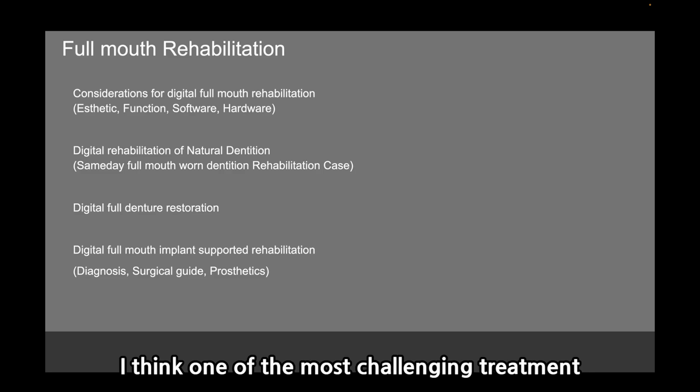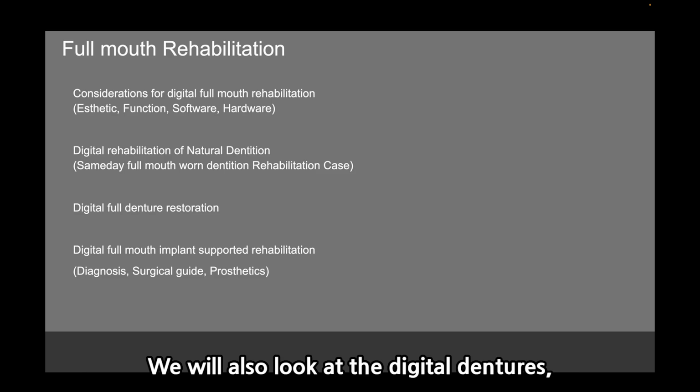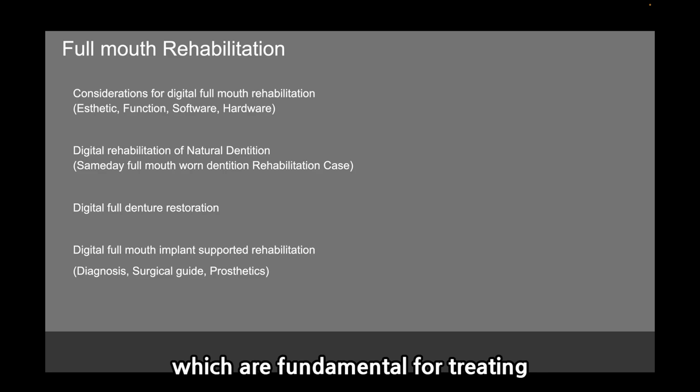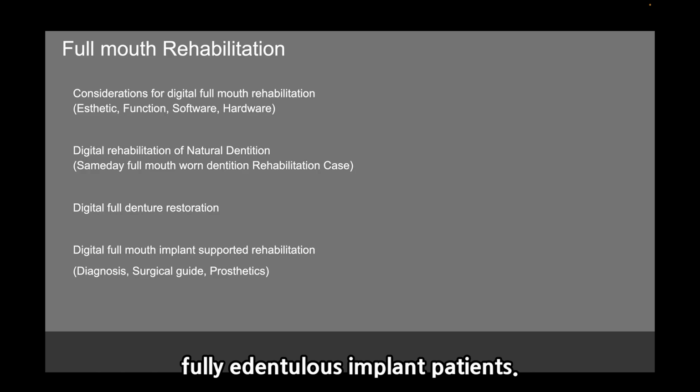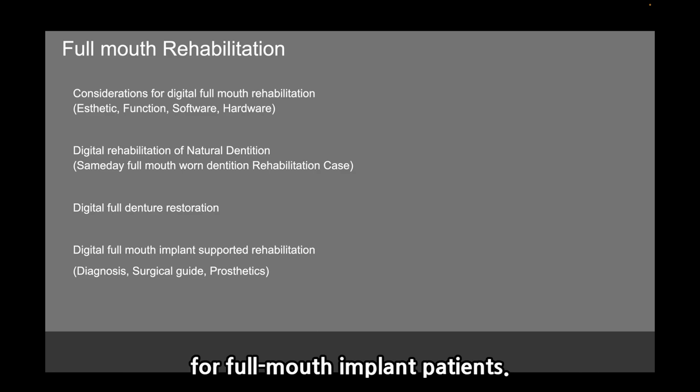I think one of the most challenging treatments is treating severely worn dentition. We will also look at the digital dentures, which are fundamental for treating fully edentulous implant patients. We can use collected information in diagnosis, surgical guide, and making temporary and final product for full mouth implantation.